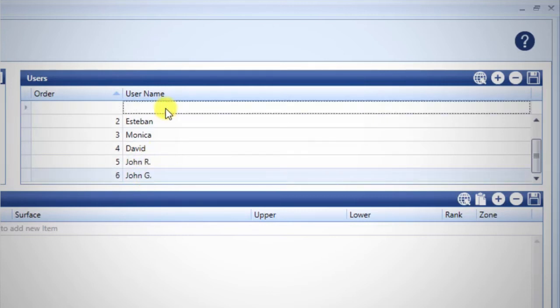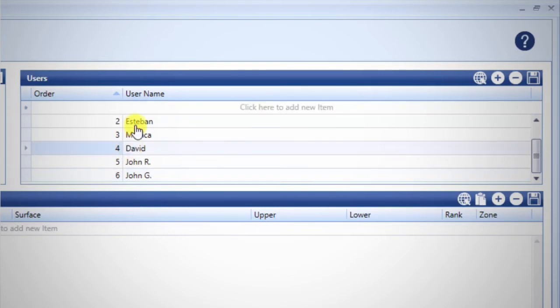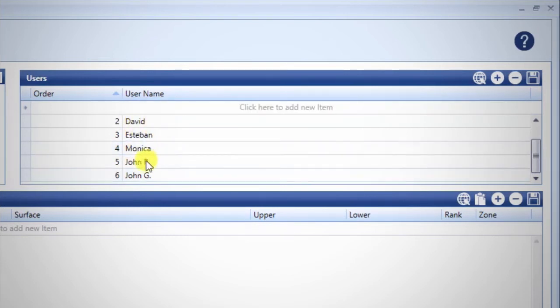Once all users are listed, you may rearrange the order in which they will appear on the unit by clicking, holding, and dragging rows to the desired position.